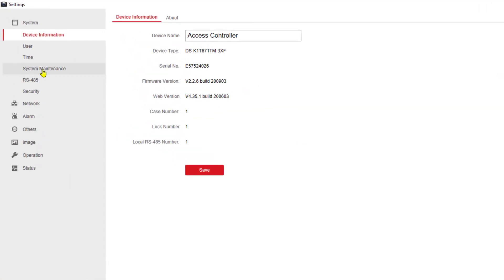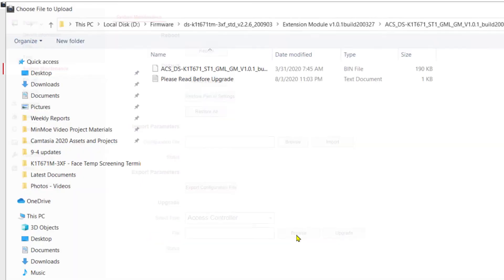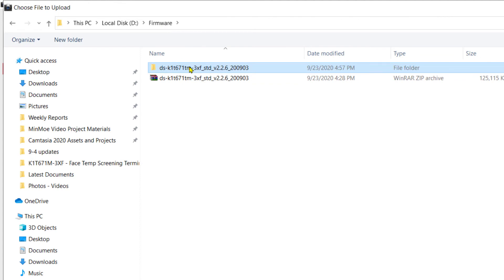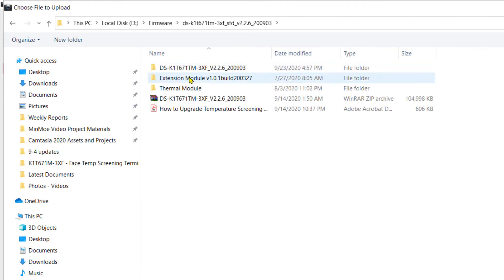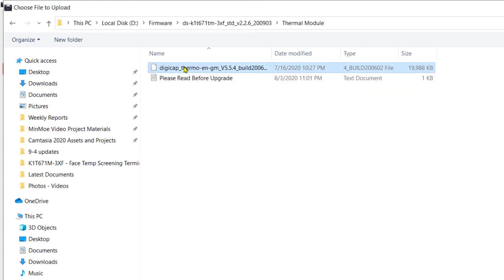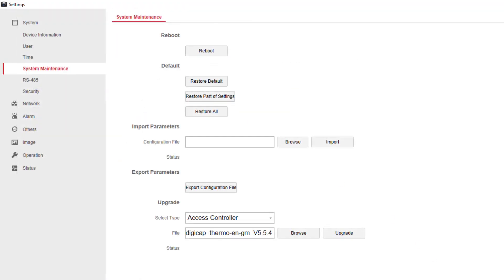So at that point, you're going to need to come back and reconnect for remote configuration just like the last time. We'll go back again to system maintenance, and this time we're going to choose access controller, but we're going to browse to the thermal file this time, the thermal module. This is a DigiCap file as well, but it's got a little bit of a longer name on it. We'll click on open and then we will choose the upgrade process on this as well.